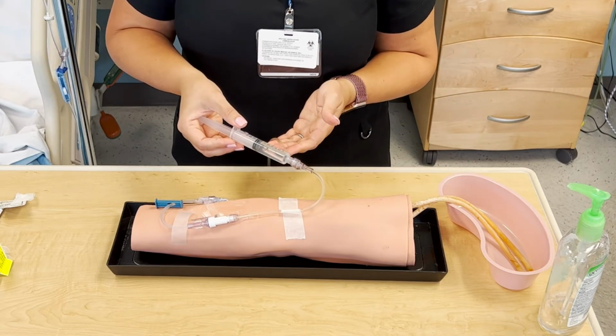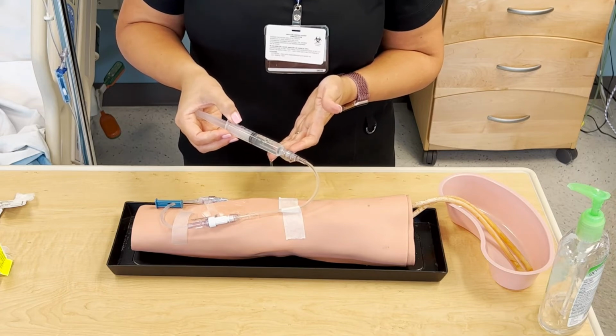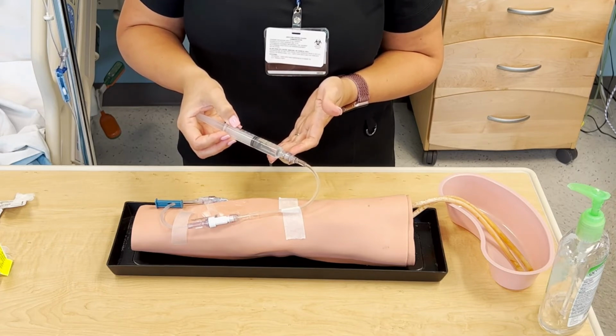Once that first milliliter has been pushed at the same rate, you can slowly push the rest, or at least 3 milliliters.